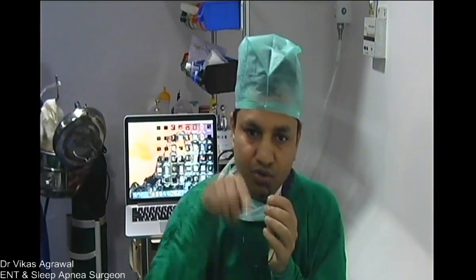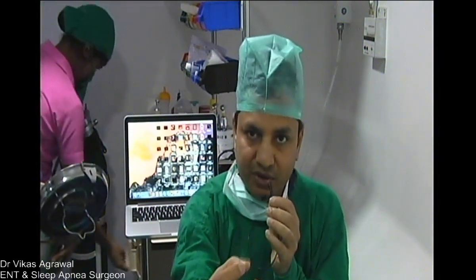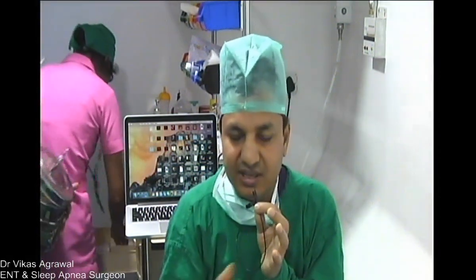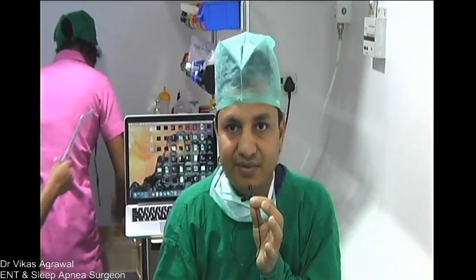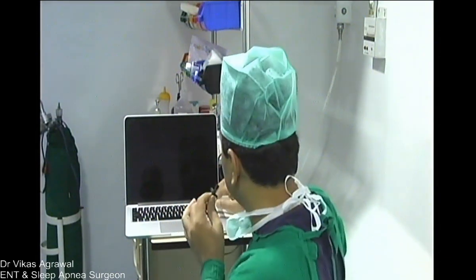So it's not a uniform channeling that you have to do with the turbinator. You have to remove the posterior part completely, anterior part differently, lower part differently. Therefore, I do not feel great advantage with the turbinator wand. I am a fan of the usual coblation technology, as you all know, but this turbinator wand, I believe, has to be still modified and made better.